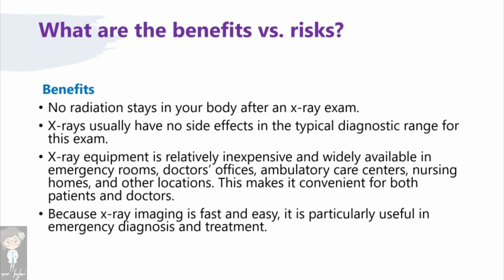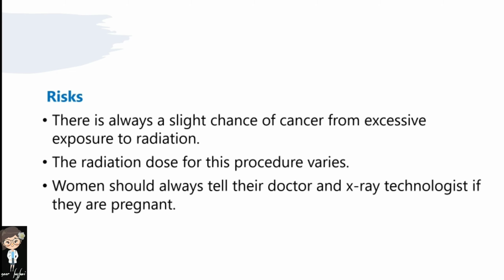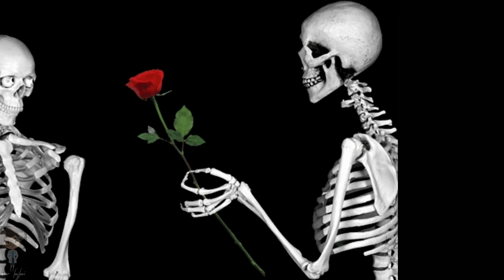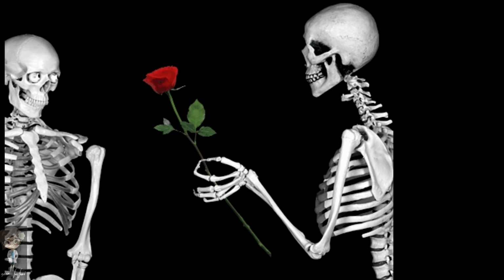Now we will see some risk factors of X-rays. There is always a slight chance of cancer from excessive exposure to radiation. Radiation dose varies for different procedures and it can affect the fetus, so pregnant ladies should tell their doctor or X-ray technologist before an X-ray examination. So this was all about chest X-ray reading and the diseases which can be pointed out from chest X-ray examination.